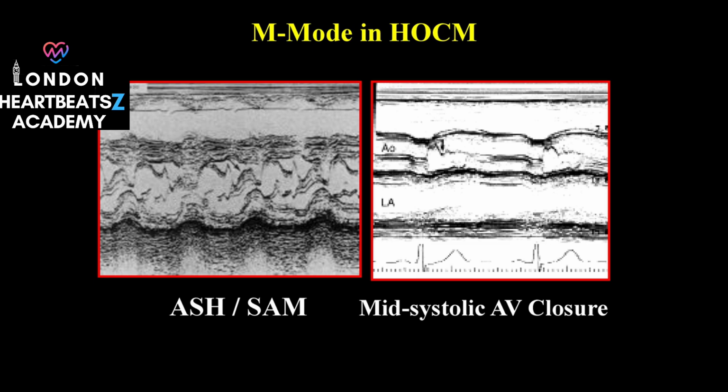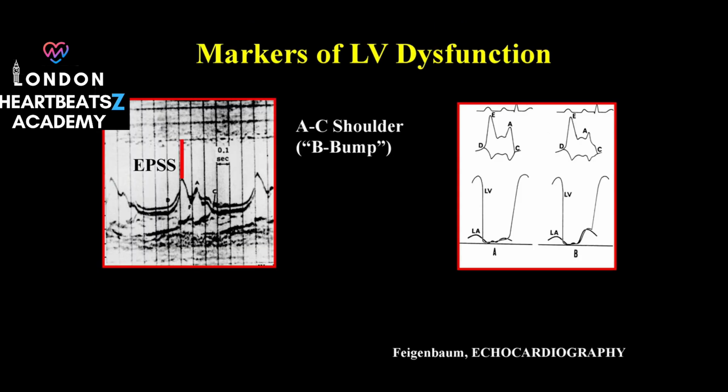And I'm guessing catching this early is important. What are the implications if a flail mitral valve is left untreated? You're absolutely right. A flail mitral valve can lead to mitral regurgitation, where blood leaks back through the valve instead of flowing forward as it should. This can put a significant strain on the heart and eventually lead to heart failure. M-mode's ability to spot these subtle movements early on can be life-saving. It allows for timely intervention and a much better chance of managing the condition effectively. That's incredible. So M-mode is like an early warning system, alerting cardiologists to potential problems before they escalate.